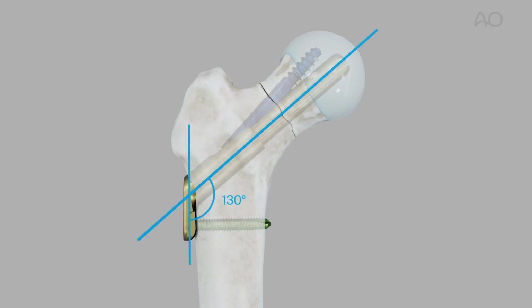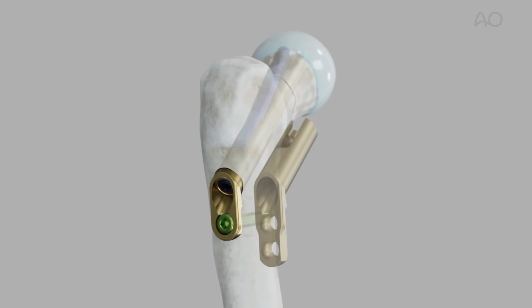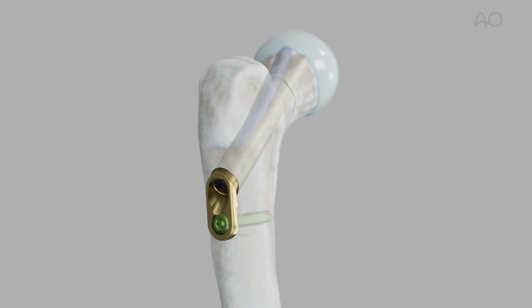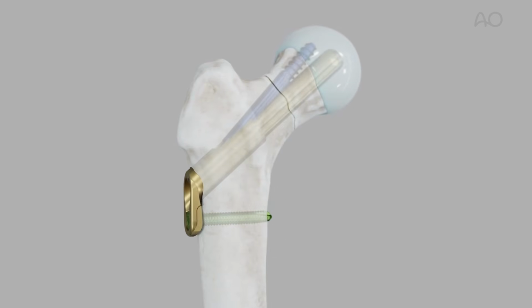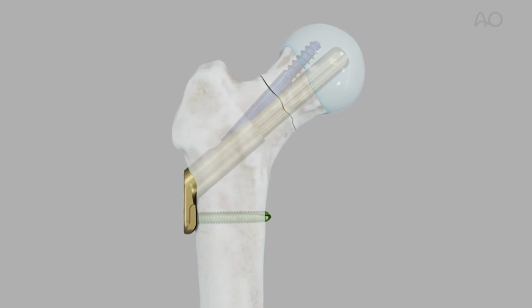The FNS plate used in this demonstration is a one-hole plate. Two-hole plates are optionally available. For below-average femur anatomy, the pre-collapsed insertion technique, shown in the final chapter, can be used.